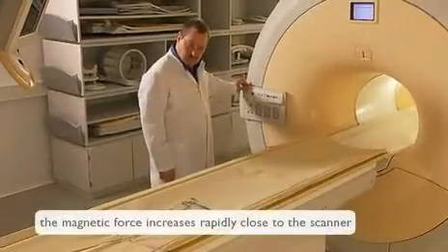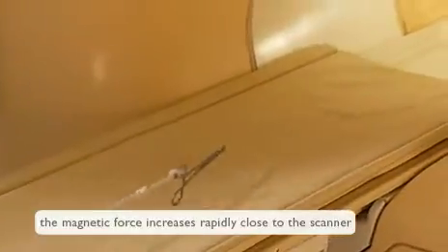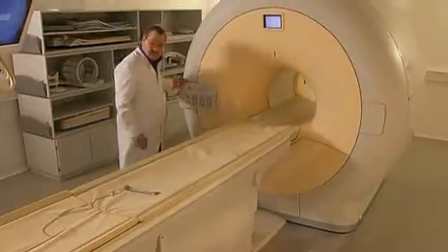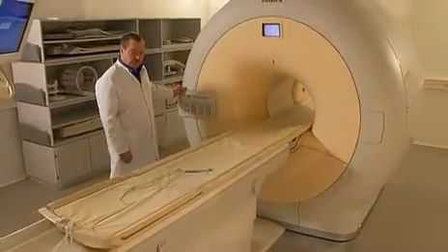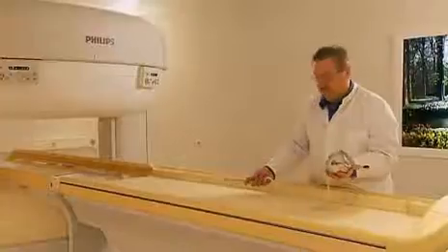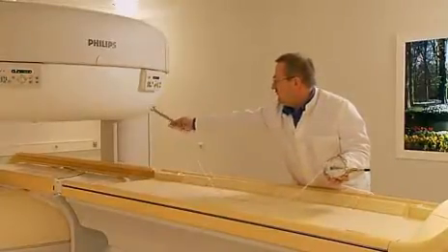The magnetic force increases rapidly as you get closer to the system. If we hold an object a few meters from the magnet, we might feel little force, but closer to the magnet, the forces are substantially higher. This effect is even greater in the case of the actively shielded magnets.